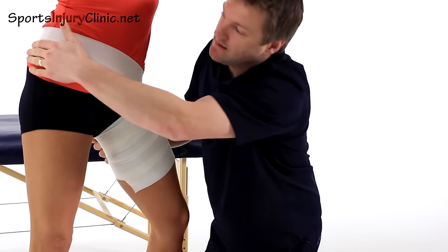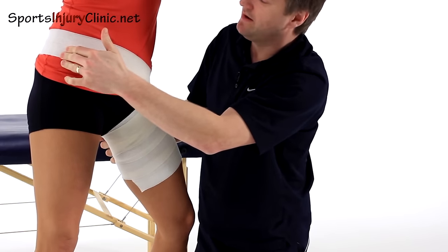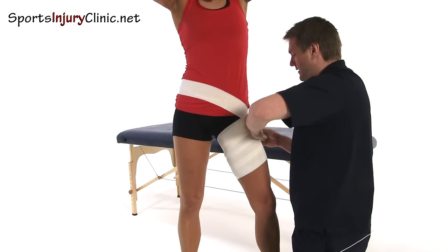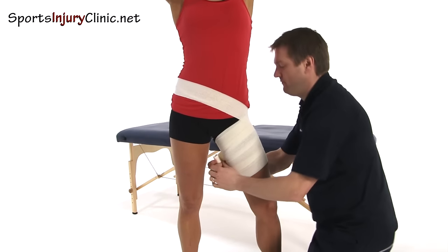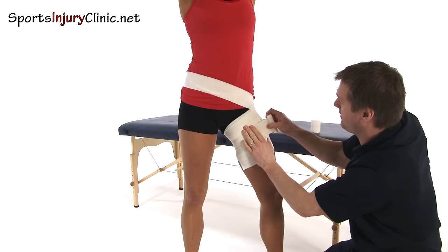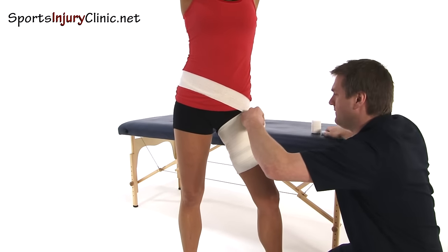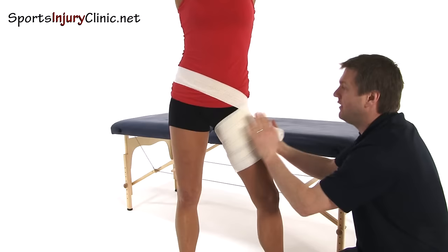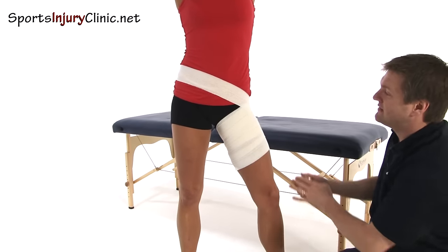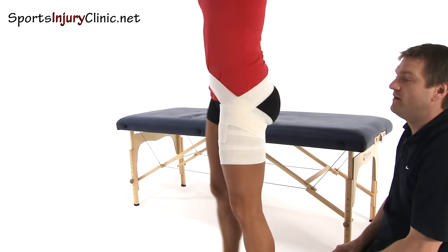This needs to go around the bony part of the hip on the other side. Again, ideally it needs to be against skin, and it's going to wrap around and finish on the thigh muscle. You can always repeat that again — do another one over the top, a little bit lower, so that effectively this works as a support for a groin strain.